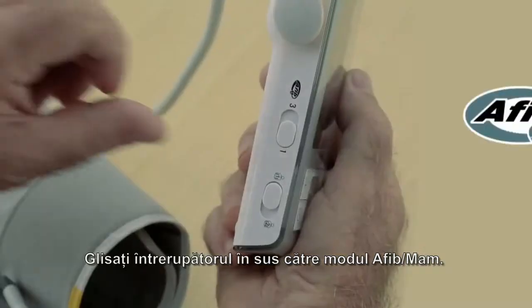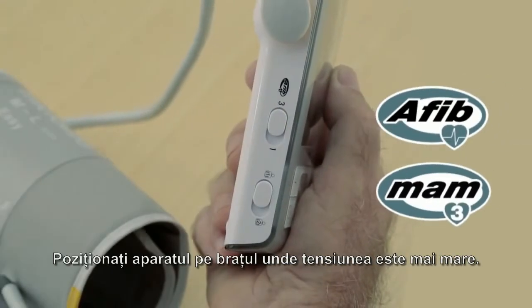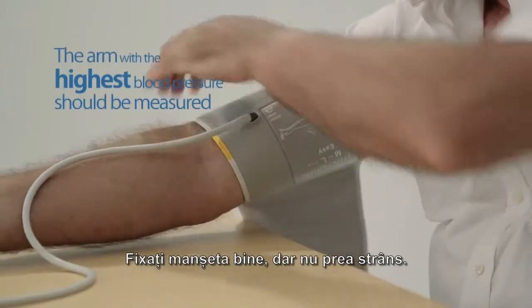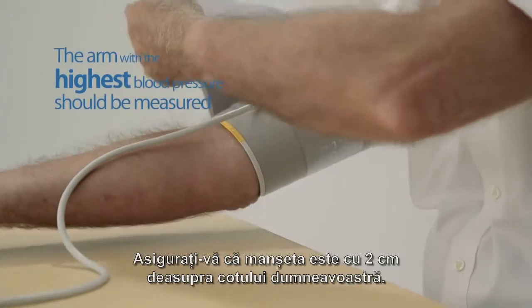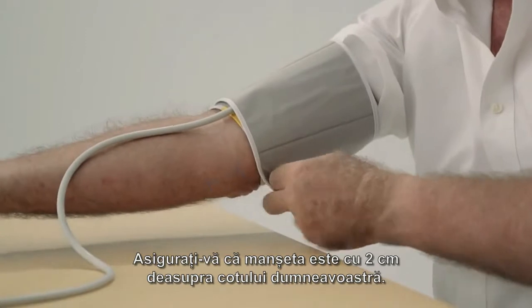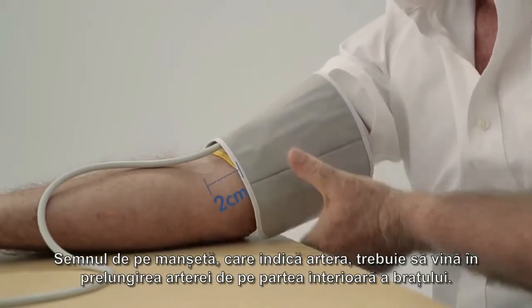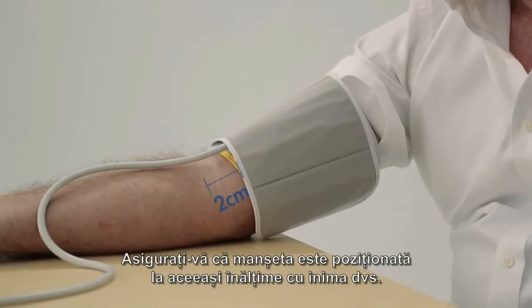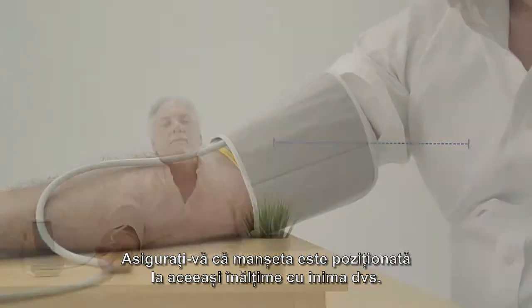Slide the switch upwards to AFib mode. The arm with the highest blood pressure should be measured. Fit the cuff closely but not too tight. Make sure the cuff is 2 cm above your elbow. The artery mark must lie over the artery which runs down the inner side of the arm. Ensure that the cuff is at the same height as your heart.